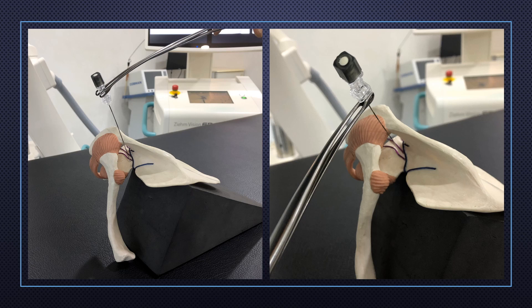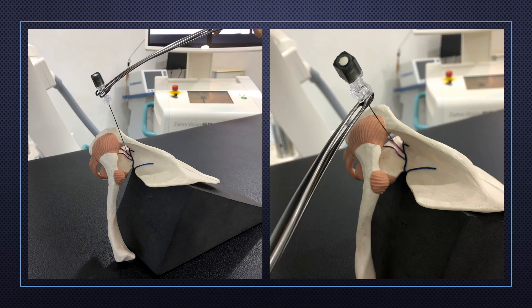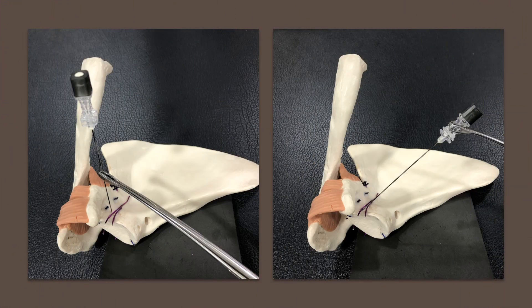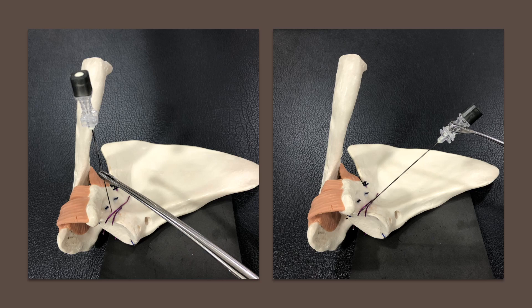This is the model of needle approach to the lateral trunk of the suprascapular nerve. This is the model of needle approach to the superior nerve to the subscapularis.